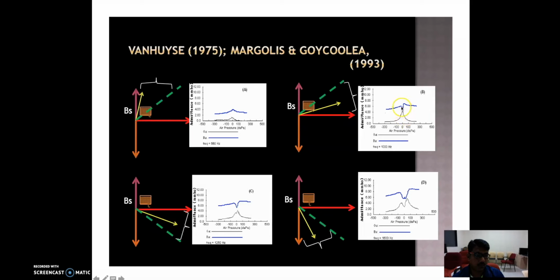Why 3B? This is based on the extreme values. In this graph there's only one extreme value, that is the positive peak, but in this graph there are three extreme values. One is here, one is here, and one is here. So two positive extremes and one negative extreme makes it a 3B 1G graph. This happens when the impedance vector is flowing between plus 45 and 0 degree.